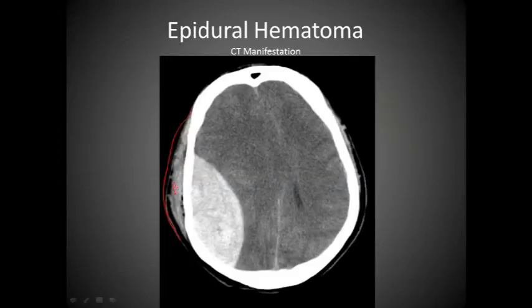We have blood in this area, and then we also have the epidural hematoma here. I notice that it's on the side of the head in the temporoparietal area. I notice we do have a shift. See how we have bowing going inward? This inward pressure is basically caused by this epidural hematoma. So we can reasonably suggest that this patient did have blunt force trauma.